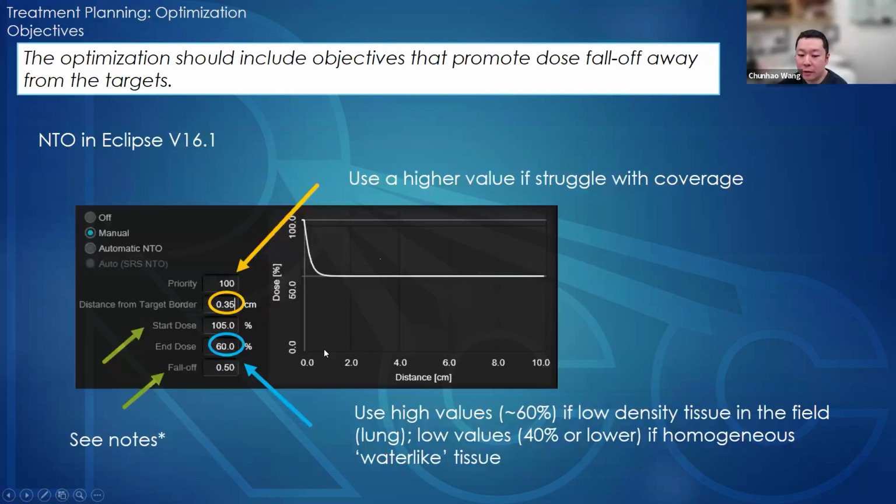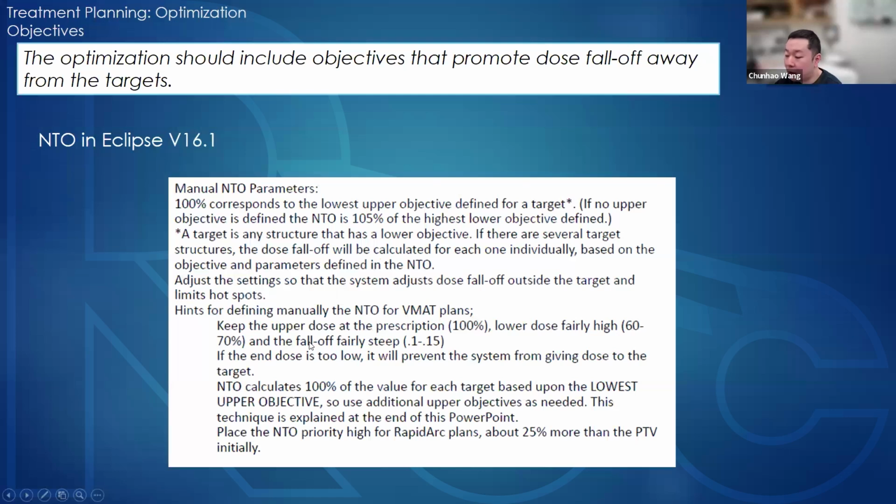And here, regarding the start dose and the fall off, I'm attaching a very brief screen capture of the Varian technical guide. We don't have time to read through every one of them, so I'm going to keep it here. If you're interested, you can come back and take a look.